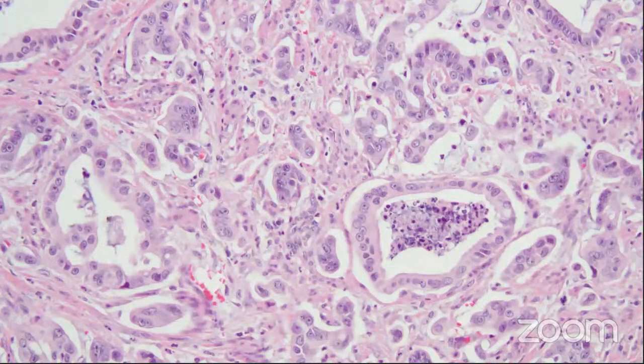These tumors can also become very poorly differentiated, in which case they lose all the characteristics with the voluminous cytoplasm and just look like poorly differentiated adenocarcinoma NOS. If you didn't know any better, this could look like a pancreatobiliary adenocarcinoma, and that's sort of how we can recognize them in the cervix, is when you have a tumor that looks like a pancreatobiliary tumor in the cervix.